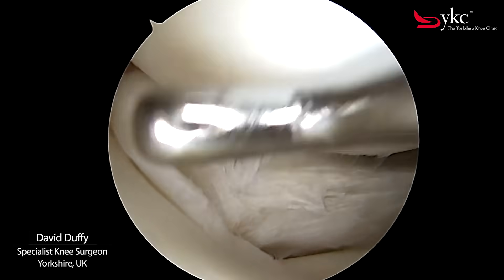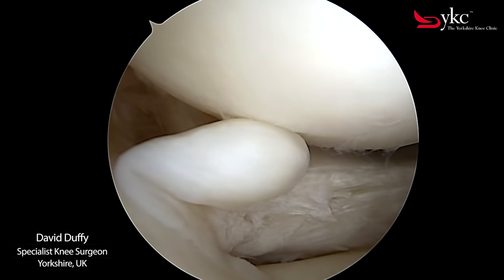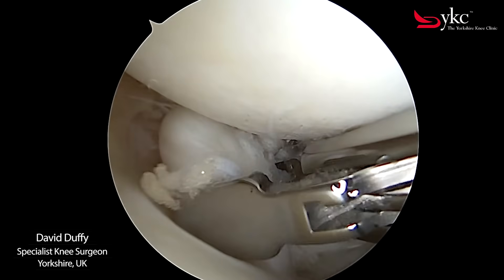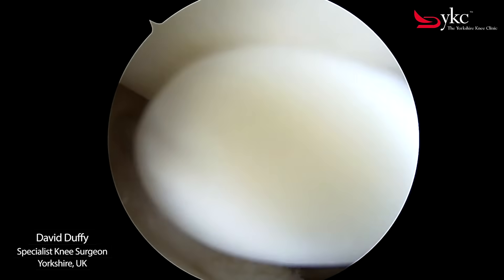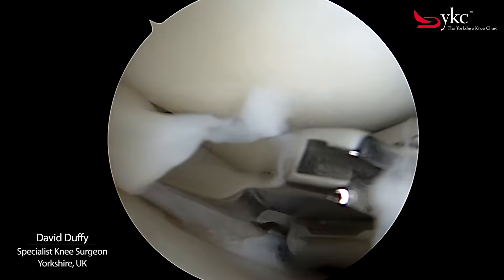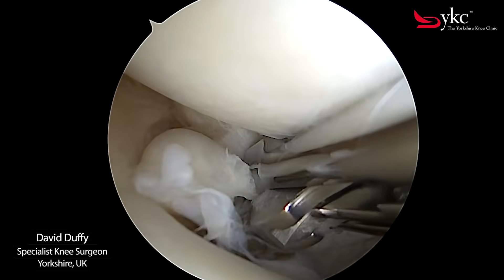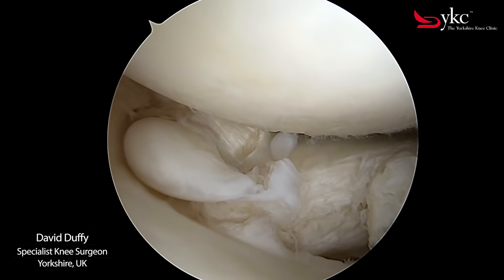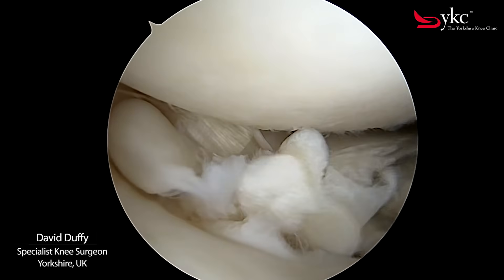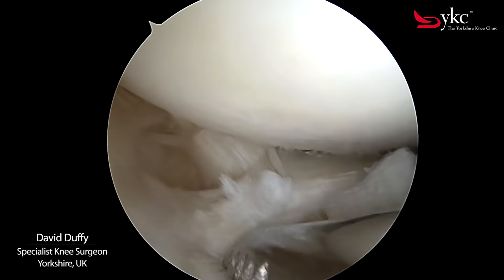In some cases tears can be repaired, however if not suitable the damaged tissue needs to be removed. An arthroscopic punch and shaver is used to remove the torn fragment. I use a shaver to remove any of the debris and loose fragments on the edge of the meniscus.